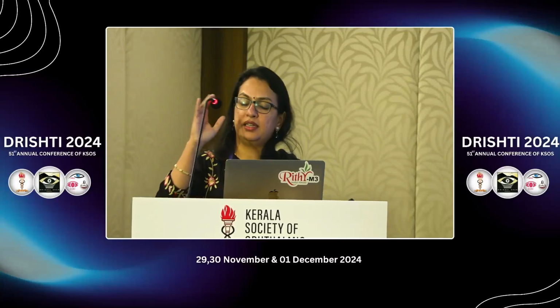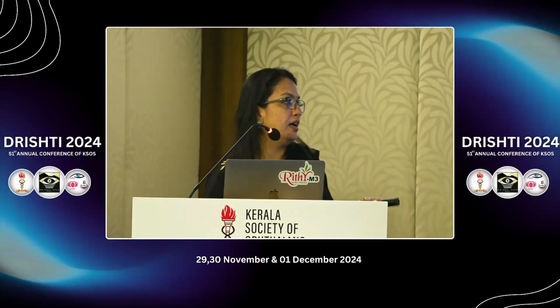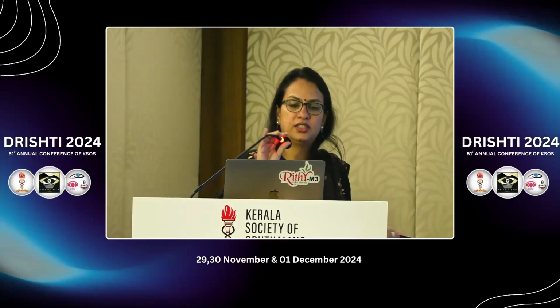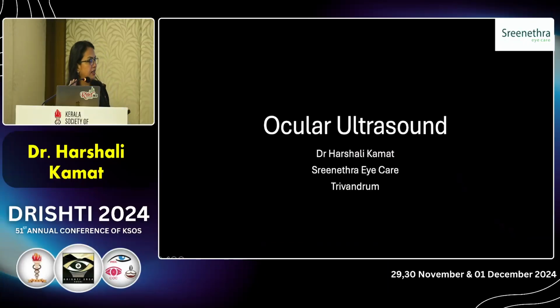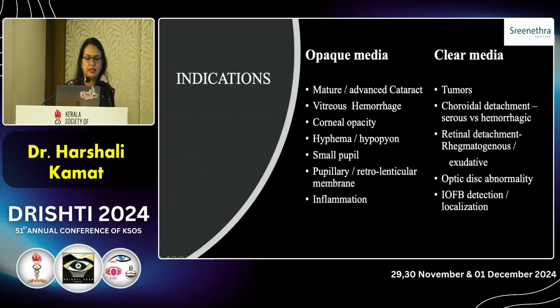Good morning, everybody. I'm Dr. Harshali. As Dr. Sharath was asking, are these imaging modalities still relevant? I think ocular ultrasound still plays a very important and relevant role even in a general ophthalmology clinic. I won't go into the physics because of the paucity of time and will lay more stress on the pattern identification of different conditions and the techniques involved.